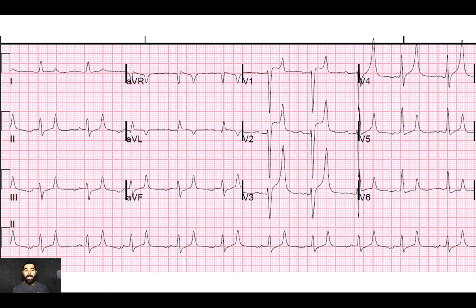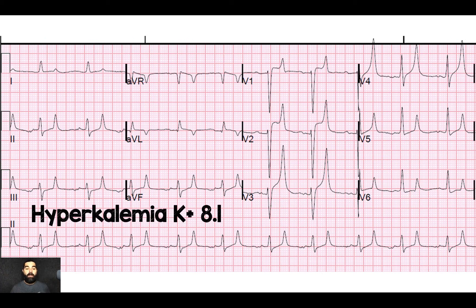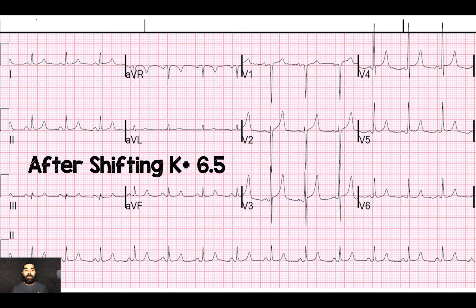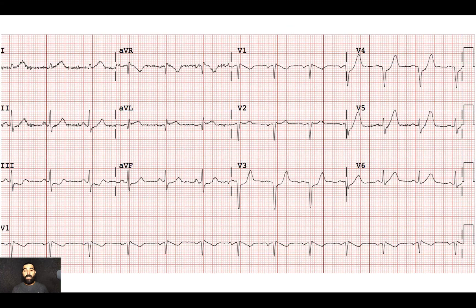Here's a dialysis patient who had missed several sessions, coming in with chest pain. Look especially at leads V3 and V4 — there are very large T waves, but they're super narrow. The patient ended up having a potassium of 8.1. We gave calcium chloride, D50 with 10 units of insulin, an amp of bicarb, and shifted them until we could get them to dialysis. A repeat EKG after shifting, with potassium down to 6.5, shows those T waves are still pretty big, especially in V3 — there's probably a component of benign early repol here as well.